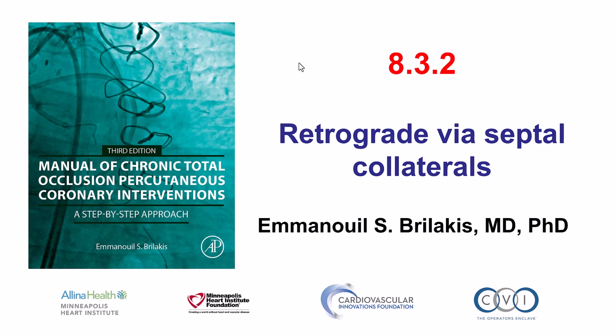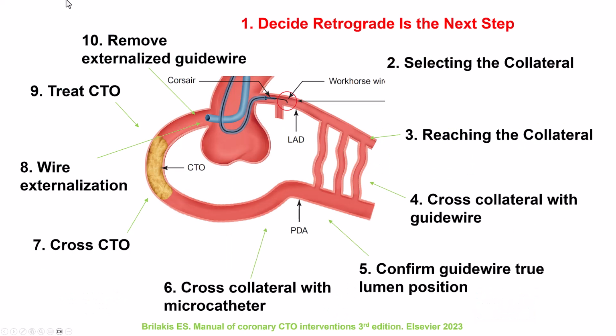This is a video discussing the retrograde approach using septal collaterals. There are 10 steps to the retrograde approach, and in this video we will cover the first 5 of them as they apply to retrograde through septal collaterals.